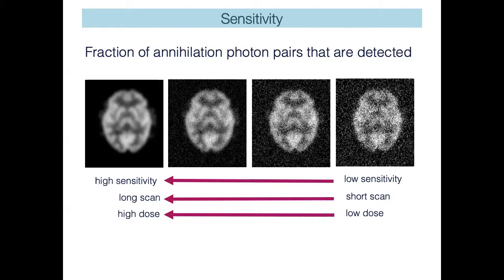It's just important to keep those things in mind because they're different from other imaging modalities where you don't inject your tracer. And of course, sensitivity is affected by your PET detector, the number of detectors you have, and the actual detector makeup itself.